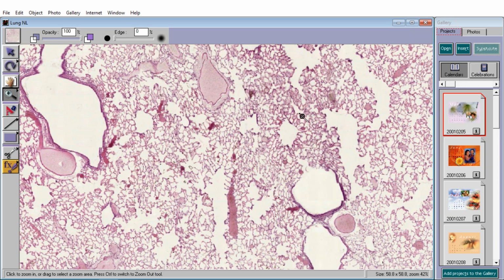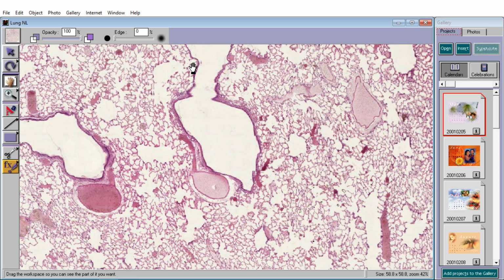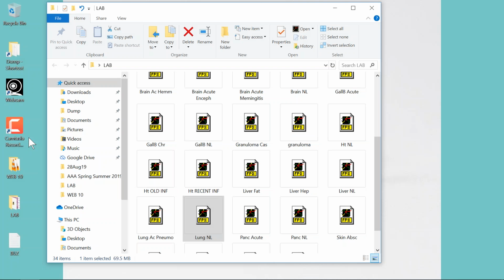Those are the alveoli. Okay, so if you want to remember all of the possible names of the cells in the lungs, knock yourself out. But if you want a quick pattern recognition, just look at a lung and say, I can see the air holes that are big, the bronchi or bronchioles. I can see the air holes that are small. And then I can see holes which contain blood, and these are the vessels. Take a quick look, because this is the world's most normal classical lung. Now let's take a look at a lung again.